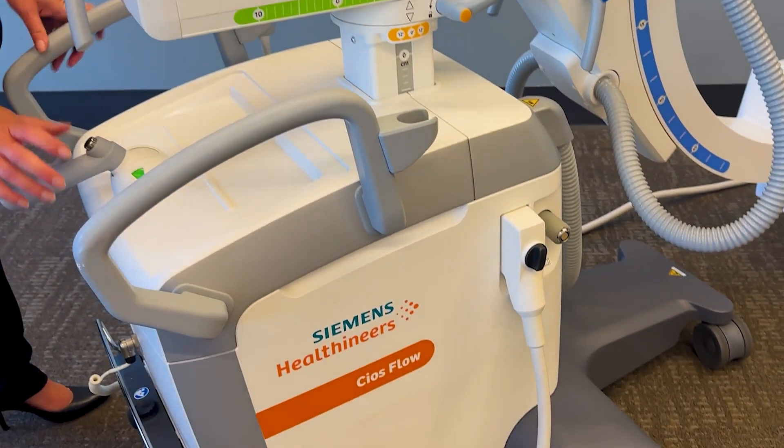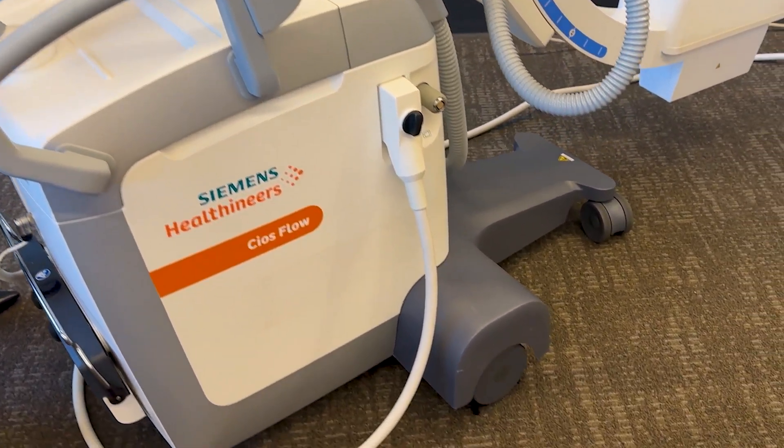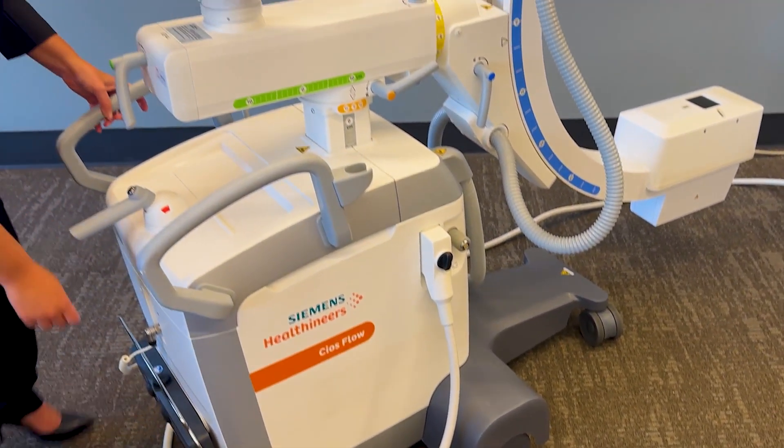Easy braking system and control of your wheels all in one system. This is how you turn your C-Arms. Easy locking system.